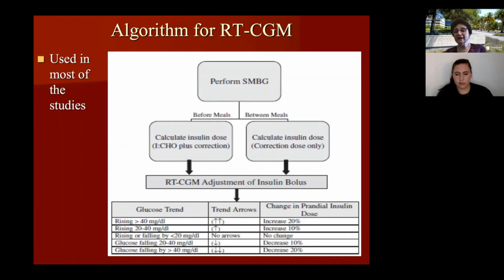You can set different profiles, for example, on the Tandem, right? You can set your low profile, where you switch to lower basal rates that are approximately 20% lower than your regular ones, right? So the algorithm will work off of those basal rates. So there are various ways of doing it.